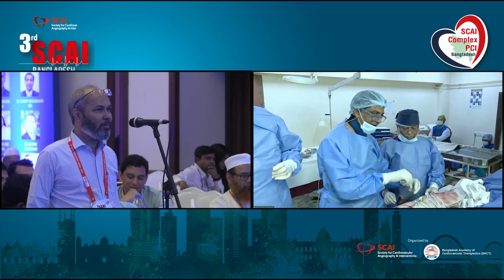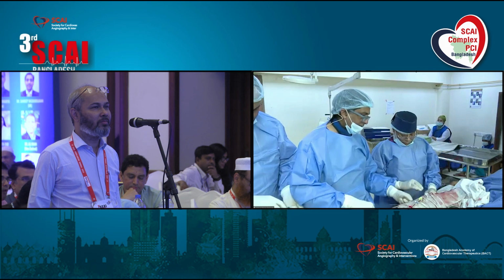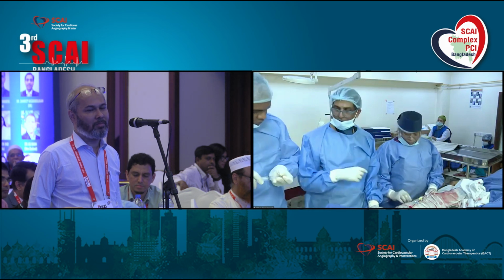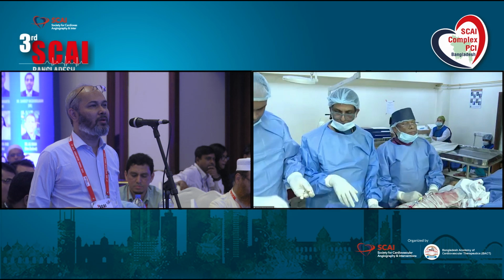Yes, I agree. There is a calcification of nearly 270 degrees. You've seen it? Right. Yeah, I think there is calcium that needs to be cracked, either with a scoring balloon or maybe with a high-pressure NC balloon, and then recheck. And for the use of DCB, can you show the IVUS again?